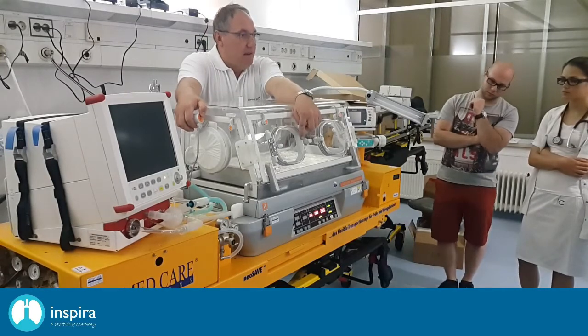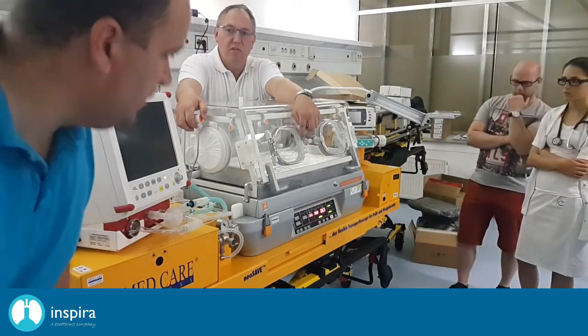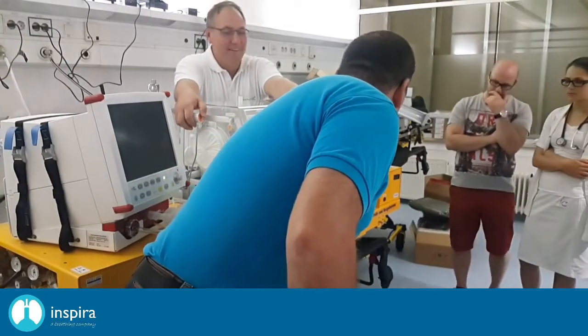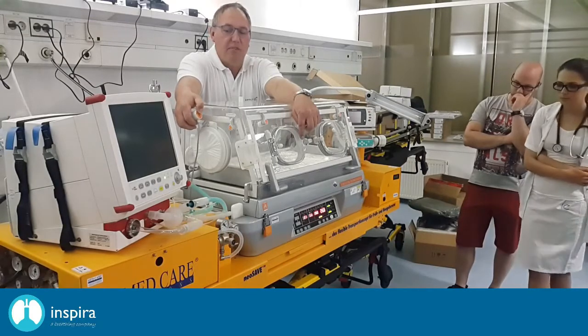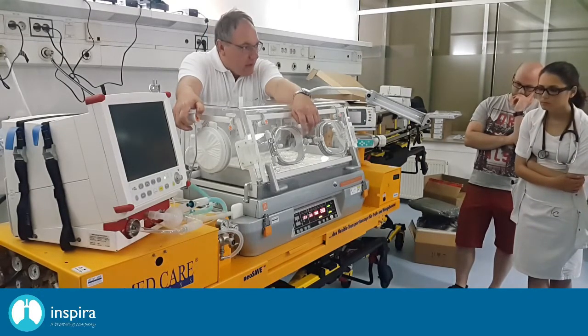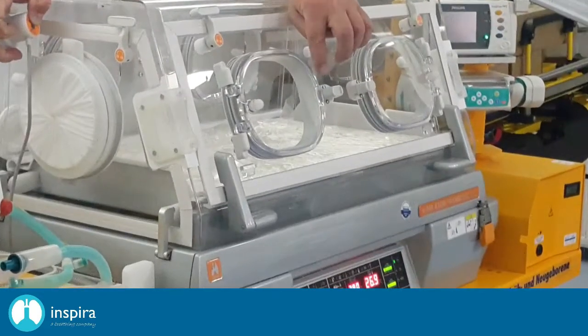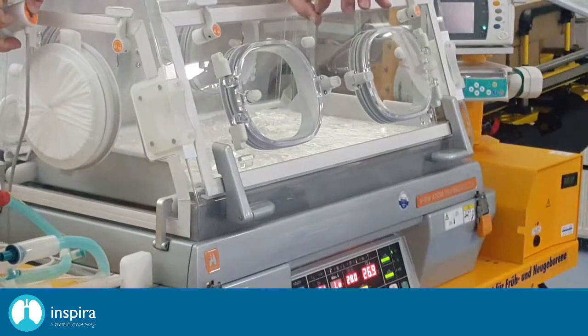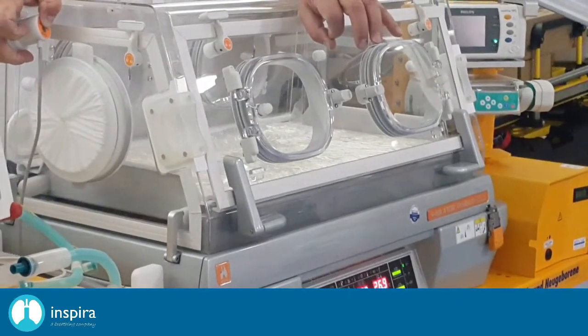Please have a look in the display. Is it switched on? No. Can you switch it on? Sorry. Thank you. Now the display is switched on, and as soon as I'm pressing the knob, the green calibration light will flash, and it takes 30 seconds to calibrate the oxygen sensor on 21% of oxygen, okay? It's only a 1-point calibration.